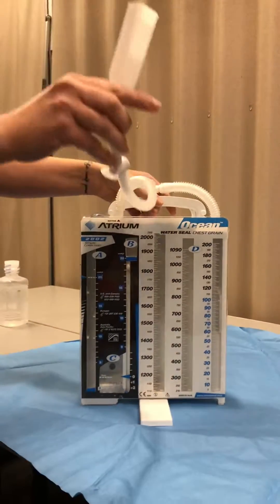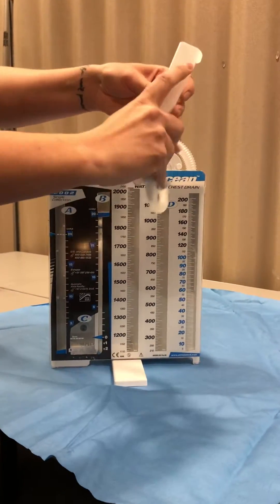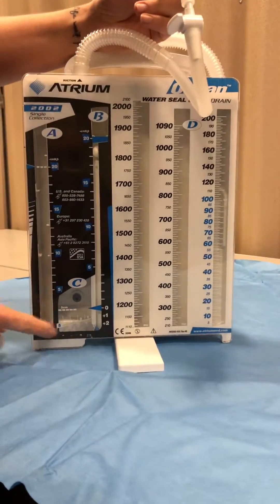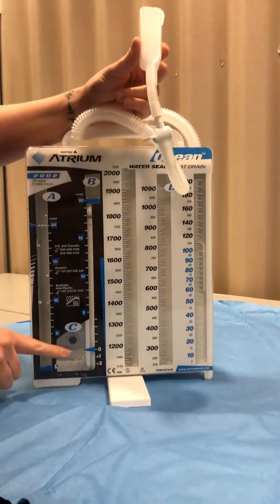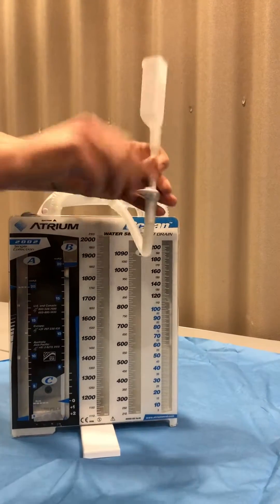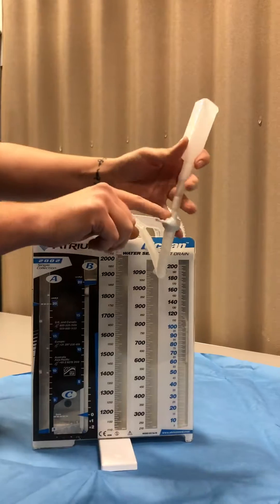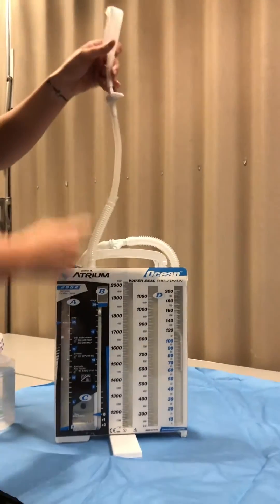The first thing we're going to do is fill this piece right here, this funnel, and it's going to drain into here into the water seal chamber. It's automatically set to fill to the two centimeter mark. So make sure that this stopcock is off, then fill it all the way up to here, turn it back, and then drain it in.